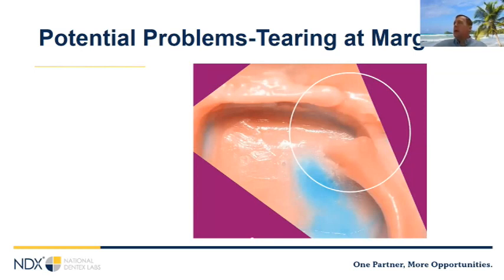So this is like big tears. This isn't that little fine tear like we're talking about. These are big tears.